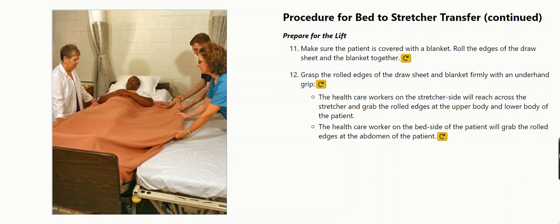The health care workers on the stretcher side will reach across the stretcher and grab the rolled edges at the upper body and lower body of the patient. The health care worker on the bed side of the patient will grab the rolled edges at the abdomen of the patient.